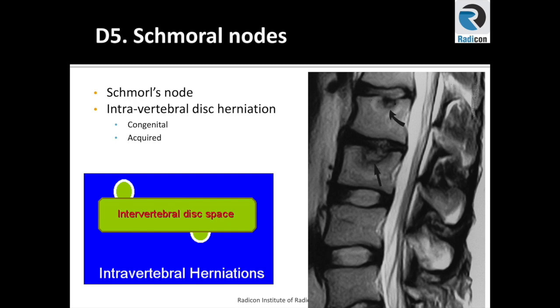When these are large, they can cause significant edema and symptoms of back pain, as seen in this case where two superior end plates have herniated disc material and Schmorl's nodes with high signal change around them. In particular, the lower Schmorl's node is much bigger with associated signal changes in most of the vertebral body and has a higher chance of being symptomatic.